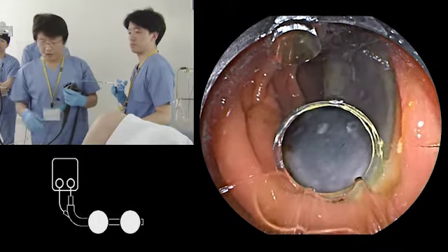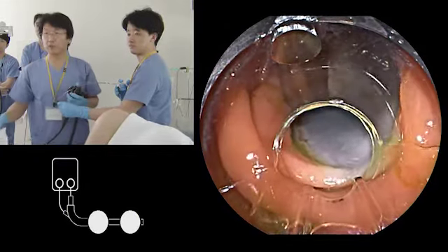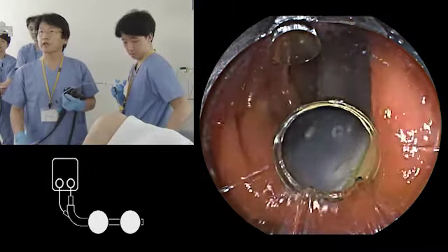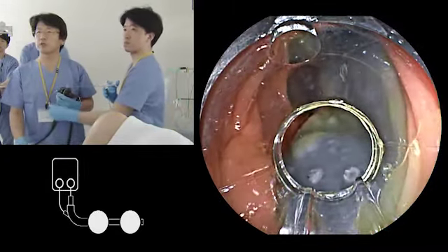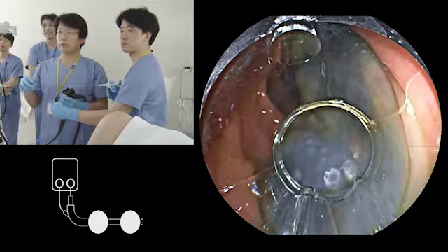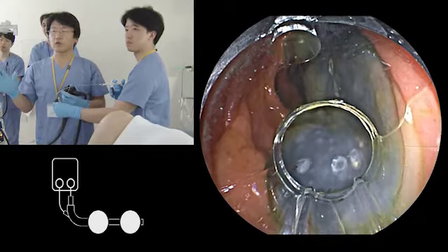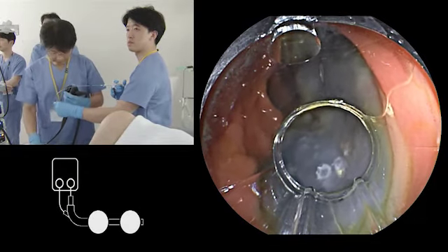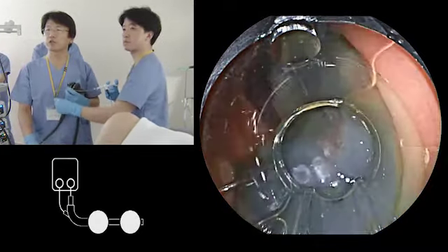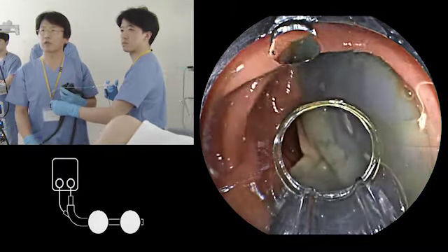So I think in the Western countries, they use a long colonoscope that makes the ESD difficult in the colon. They say that Western people are too big and too large or obese, and then the long colonoscope is necessary. But if you use this 155 centimeter double balloon endoscope, then you can perform in a very good stable condition even in a long colon or a proximal colon.